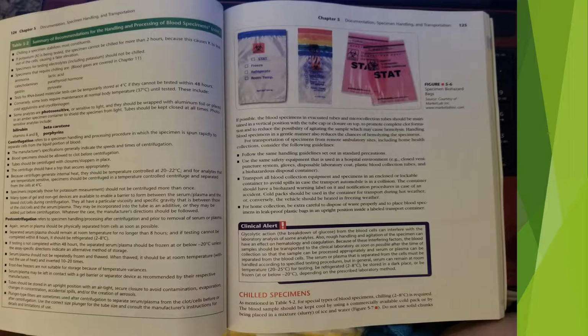Chilled specimens. As mentioned in Table 5.2, the special types of blood specimens, chilling 2 to 8 degrees Celsius is required. The blood sample should be kept cool by using a commercially available cold pack or by being placed in a mixture or slurry of ice and water, figure 5.7.